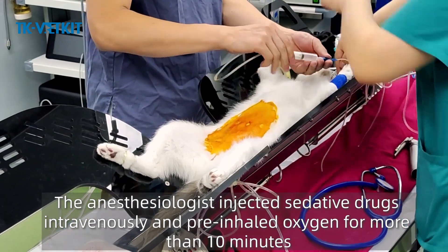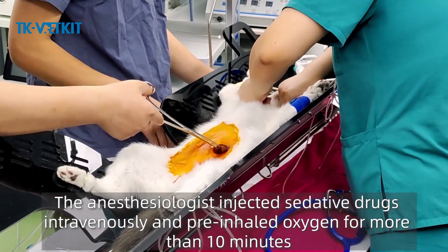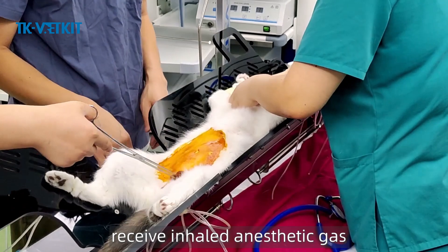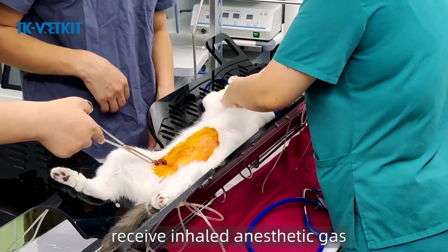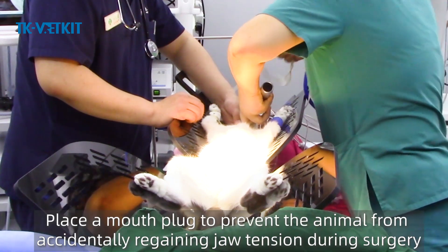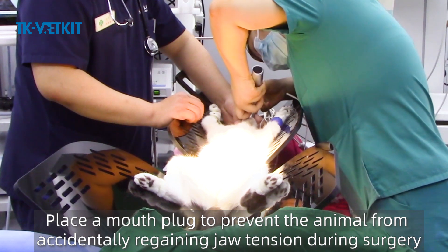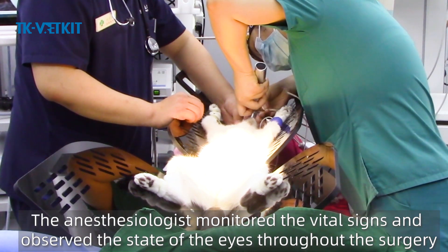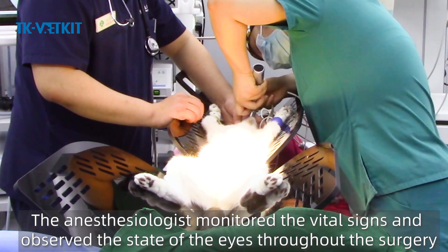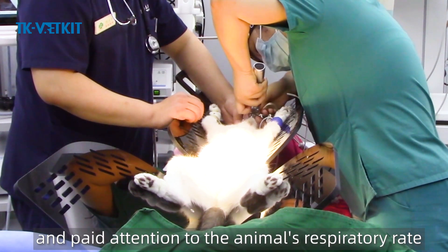The anesthesiologist injected sedative drugs intravenously and pre-inhaled oxygen for more than 10 minutes. Tracheal intubation was implemented to receive inhaled anesthetic gas, and the animal enters a stable anesthetic state. A mouth plug was placed to prevent the animal from accidentally regaining jaw tension during surgery. The anesthesiologist monitored vital signs and observed the state of the eyes throughout the surgery, paying attention to the animal's respiratory rate.